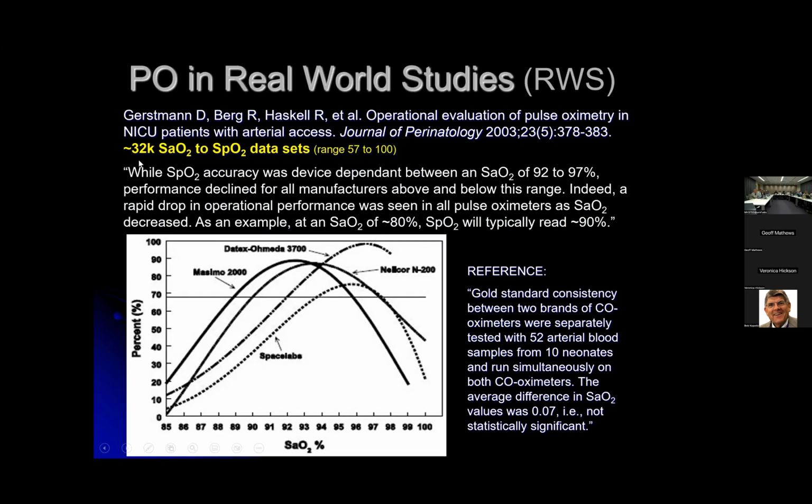Okay. So this was a study that was actually closed in 2002. So it's now essentially 21 years old. But it was a study of 32,000 time-paired data points of reference co-oximeter to baby blood gas. And so these are all co-oximetered measurements. And I wanted to be certain between these multiple sites that there was only a difference in co-oximetry performance of less than 0.1 for that.